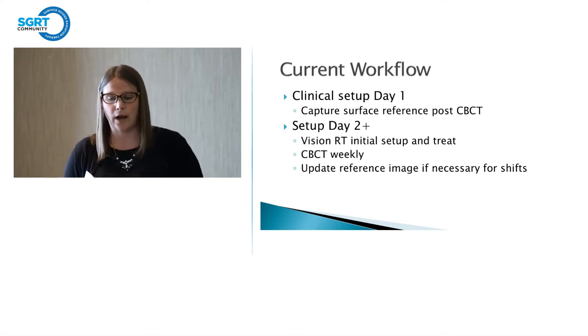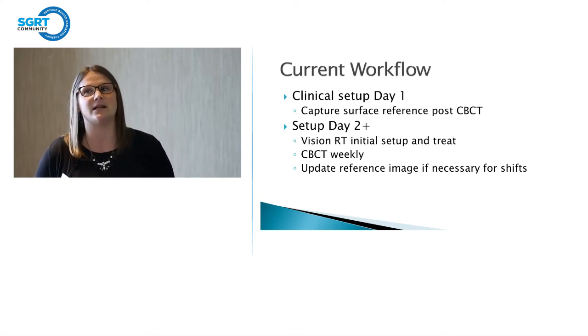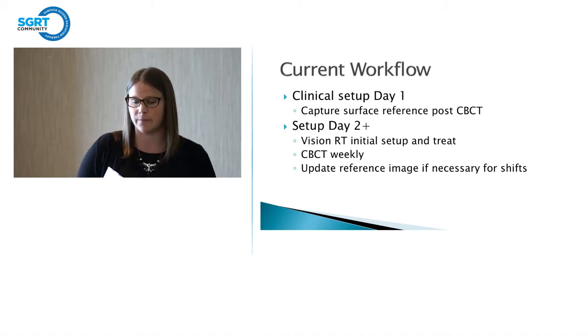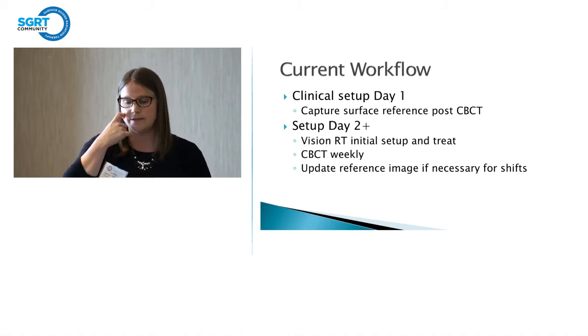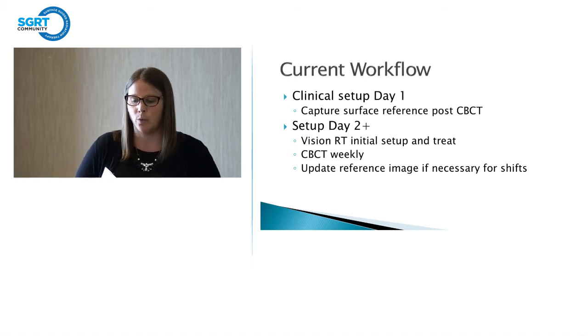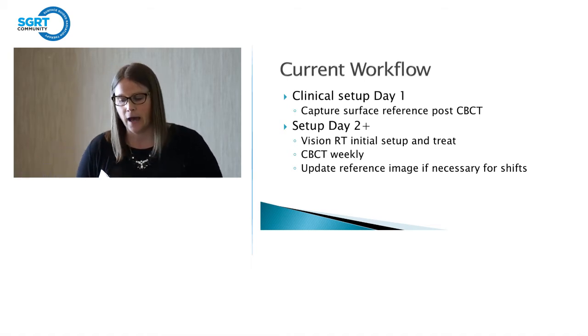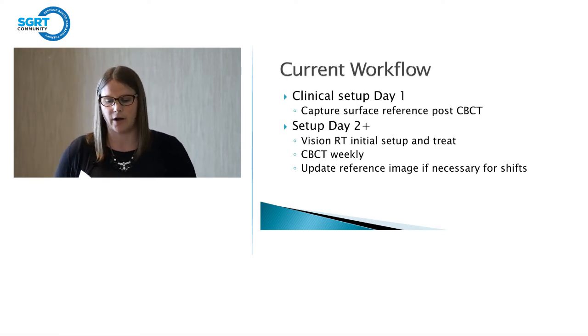So what we do now, our current workflow, is we don't send over from the CT. Our CT doesn't have Vision RT. So on the very first day, we clinically set up to the patient's tattoos. We image using cone beam. Once we have a good image, we'll capture a surface reference of the patient. And then going forward, day 2 and on, we will set up the patient the same way, aligned to the tattoos, make any prescribed shifts, and then we'll use Vision RT to make those fine-tune adjustments to get the patient right on track.